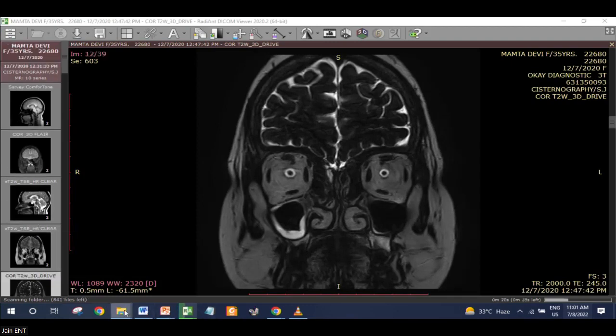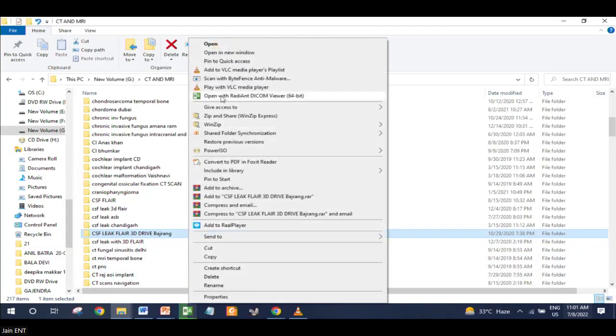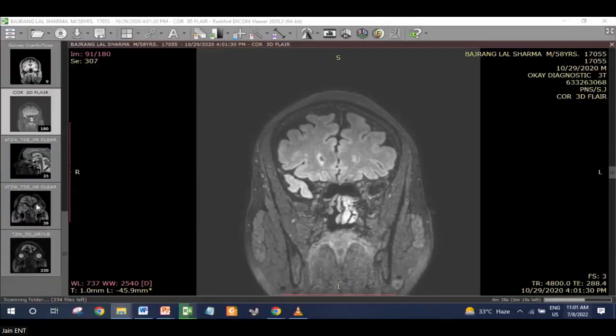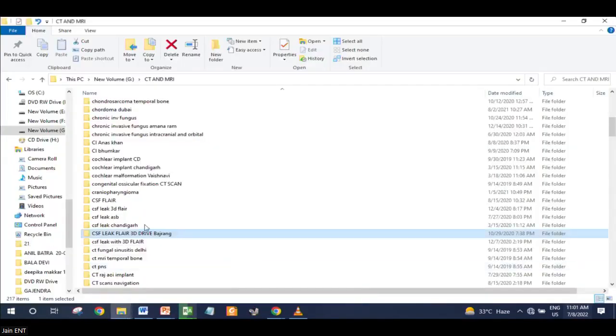Sir, good morning. Before we go ahead, sir, we have to find out what is the defect site, because the defect is in the bone. So that's why it requires a CT, sir. Yes, we had a CT scan printout before. The patient had it done several times earlier, not on DVD, and those CT scans were not fine sections, and there was hardly any defect seen.